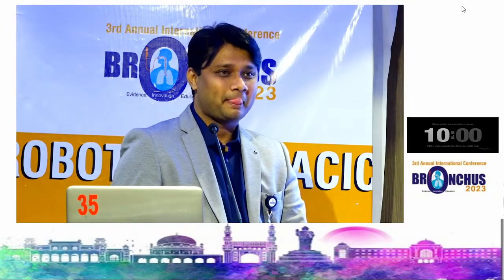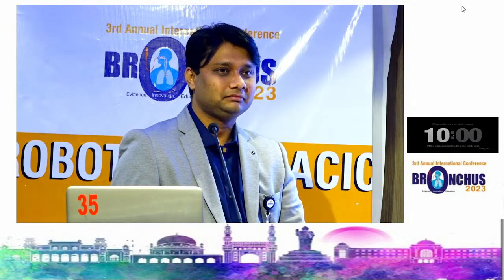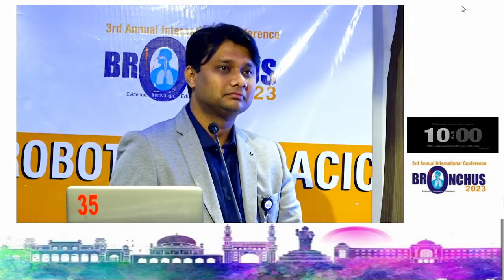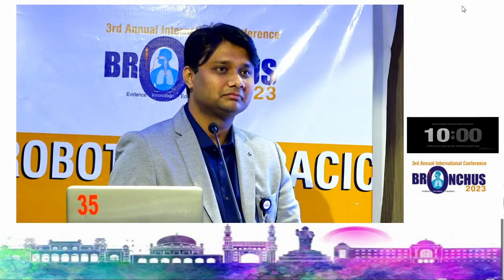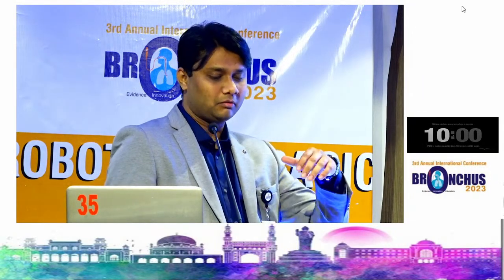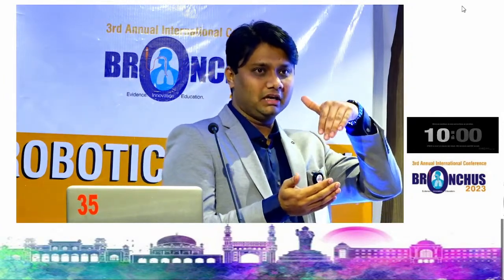Have you fractured a rib? No, in my uniportal, recently I had a fractured seventh rib probably. I was not getting the vision or the exact location with this stapler, because in India we don't get curved tip staplers. These are straight tip staplers. So take the angle. Probably that rib got ripped off.